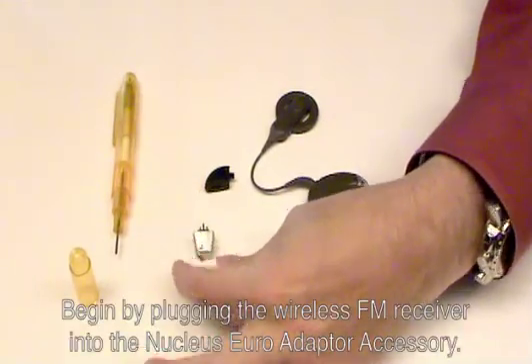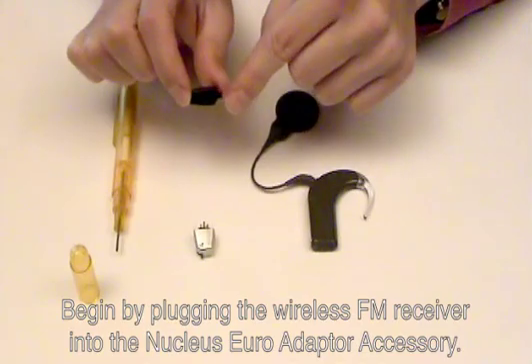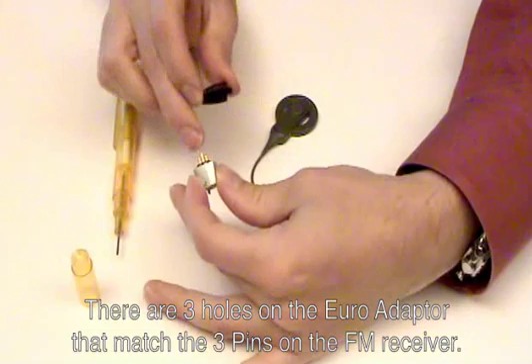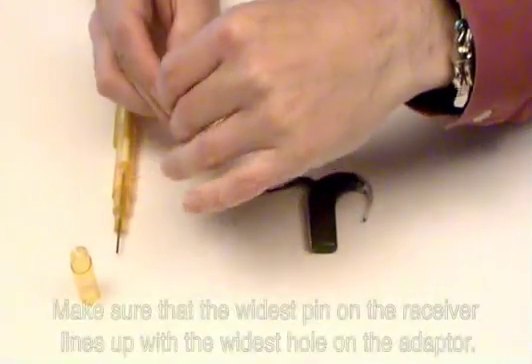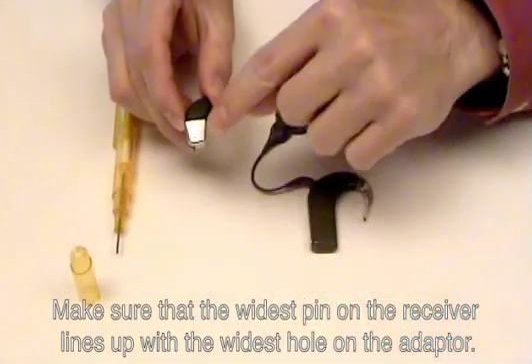Begin by plugging the wireless FM receiver into the Nucleus Euro accessory adapter. There are three holes on the Euro adapter that match three pins on the FM receiver. Make sure that the widest pin on the receiver lines up with the widest hole on the adapter.